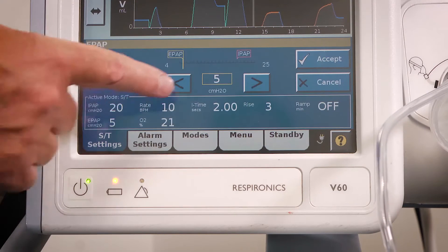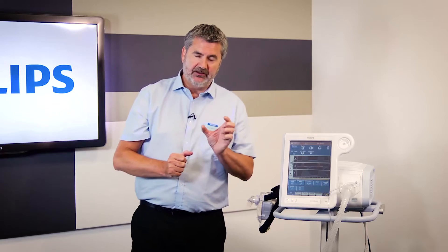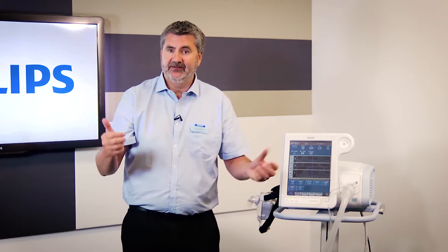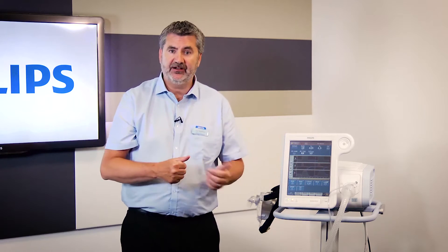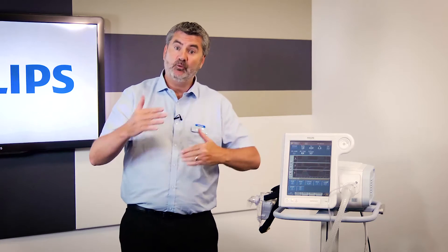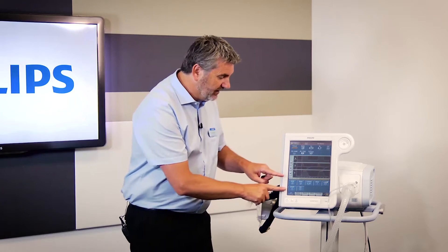We might also want to change our EPAP — let's put that to 5 and accept it. The mode we're using in BiPAP is called spontaneous timed. While the patient is breathing spontaneously — meaning they're taking a breath in and out — the AutoTrack detects when they breathe in and when they breathe out, and it follows the patient's breathing. So all you're doing is controlling the IPAP and EPAP pressures.